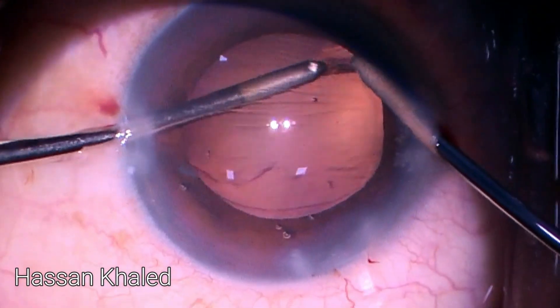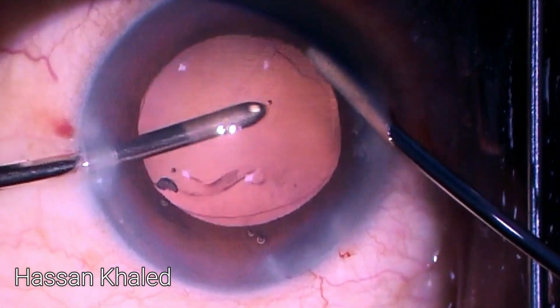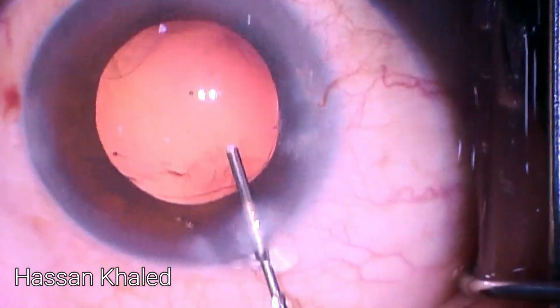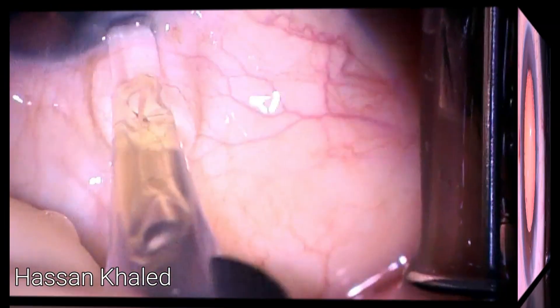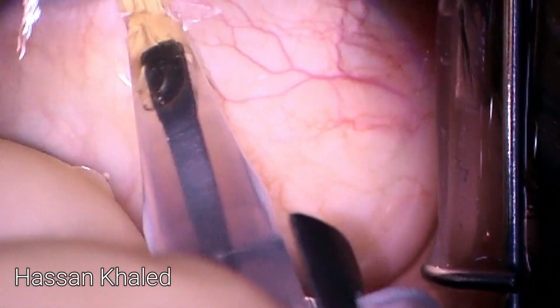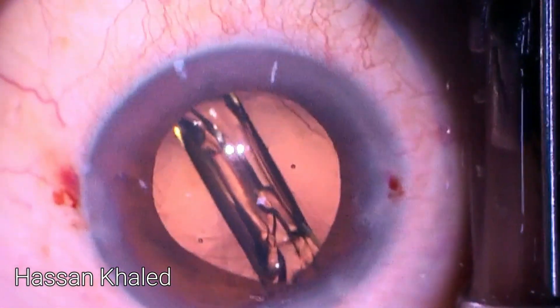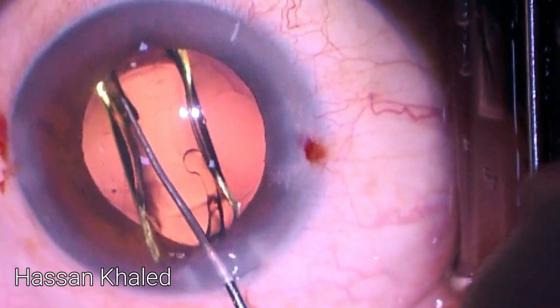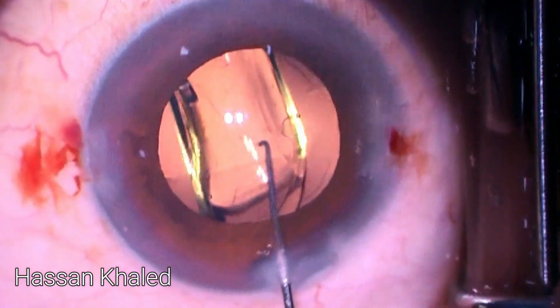Now everything is good. I inject cohesive OVD to form the anterior chamber and capsular bag, and a single-piece hydrophobic IOL is implanted inside the capsular bag, with adjusting and settling of the IOL inside the capsular bag using the Sinskey hook, as is clear. In all of my cases I wash the viscoelastic both anterior and behind the IOL as usual.